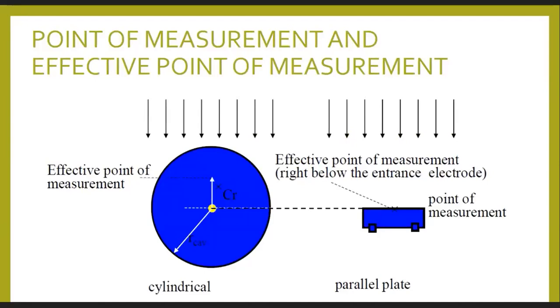In the case of cylindrical chambers, the placement of the detector is referred to the central axis of the chamber.